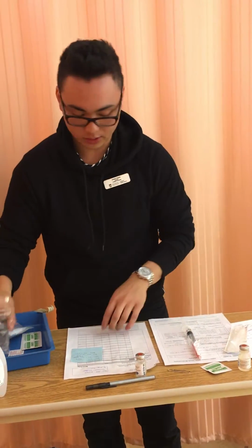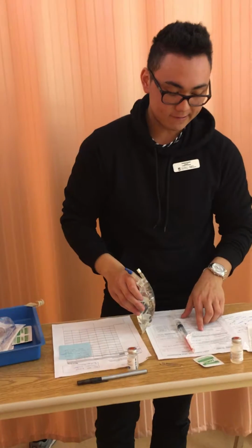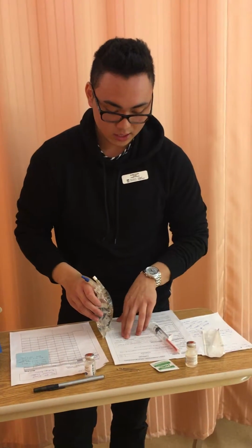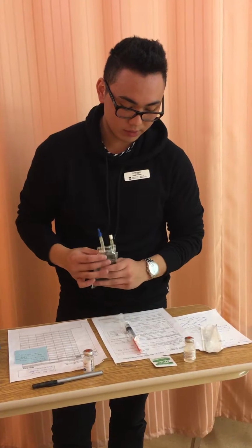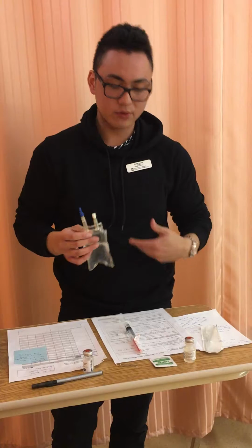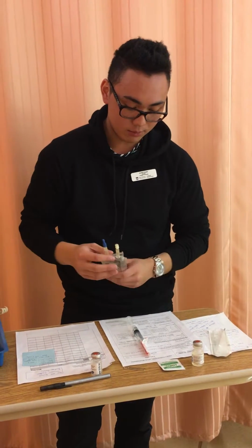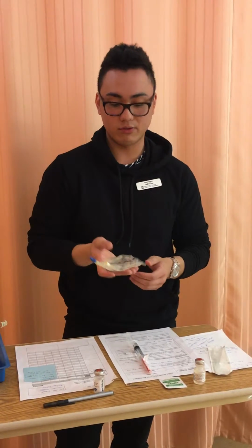The drug monograph also states that we need to dilute this medication in 10 to 100 milliliters of D5W, normal saline, or a combination of dextrose and saline, and administer it over 20 to 60 minutes. I chose to use 100 milliliters of normal saline because if someone's having a respiratory infection, the more fluid they get, the easier it is to secrete. The secretions become thinner and easier to get rid of. And I'm also choosing to administer it over 60 minutes because I don't want my patient to be fluid overloaded.